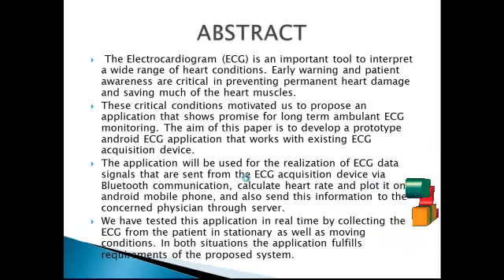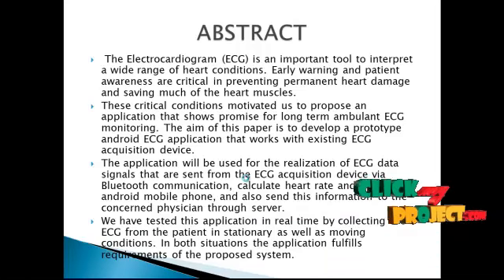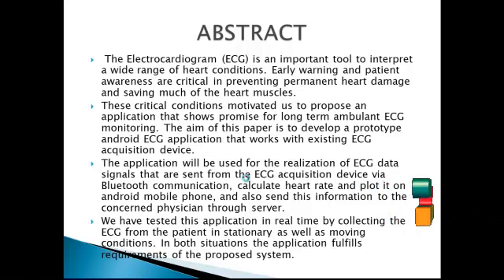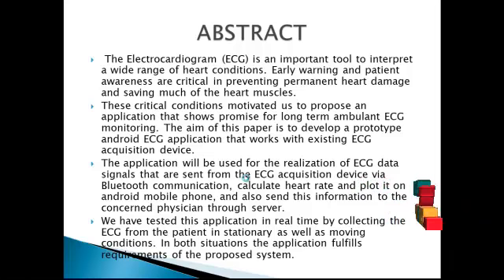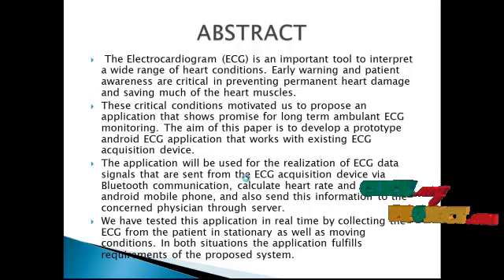The electrocardiogram is an important tool that interprets a wide range of heart conditions. Early warnings and patient awareness are critical in preventing permanent heart damage and saving much of the heart muscle. These critical conditions motivated us to propose an application that shows promise for long-term ambulatory ECG monitoring.